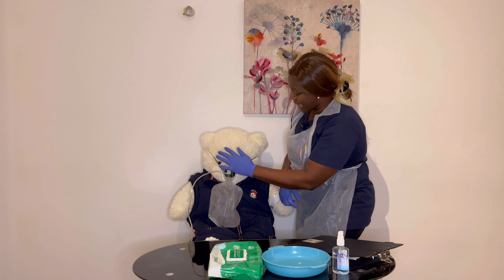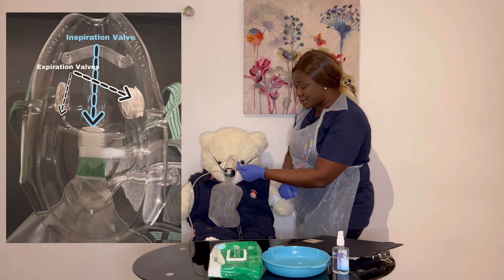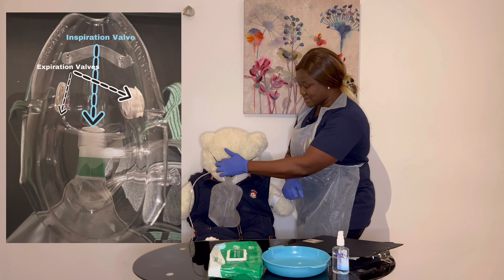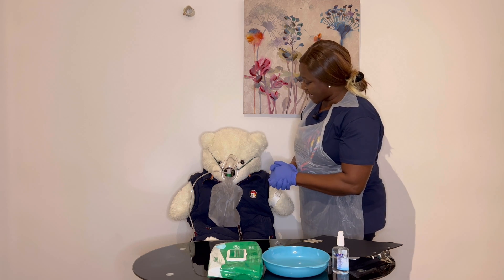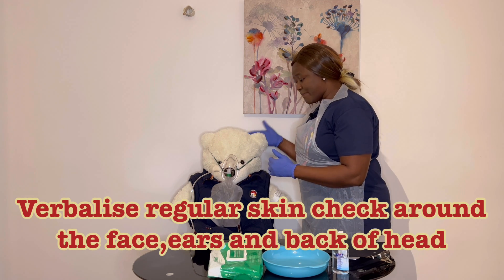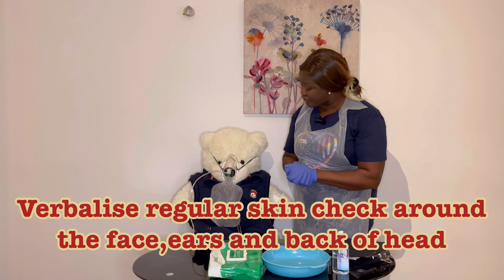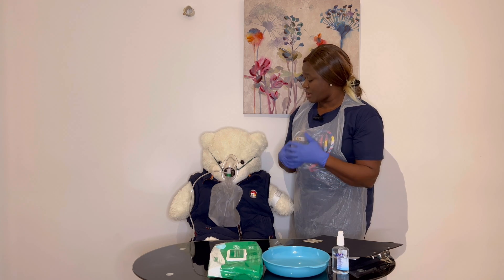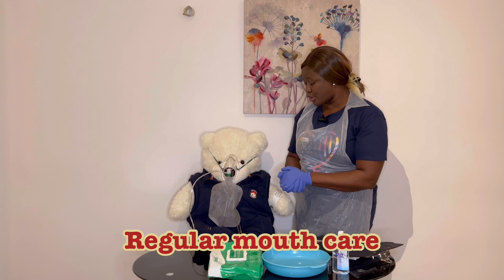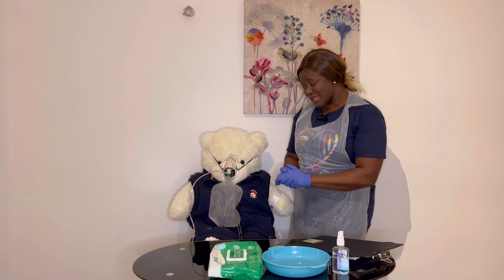Are you okay JJ? Yes, are you comfortable? Yes. There is an exhalation valve on both sides — exhaled air goes out through that valve. JJ, I'll make sure to do a regular skin check on you — both the back of your head, your ears, and the skin around your face. Some side effects of oxygen therapy can include dryness of the mouth and dryness of the nasal mucosa, but we'll do regular checks and oral mouth care to keep you comfortable.